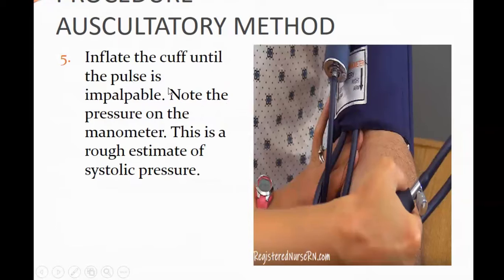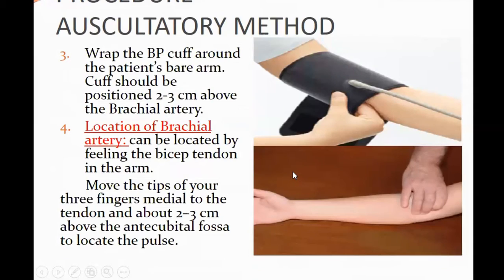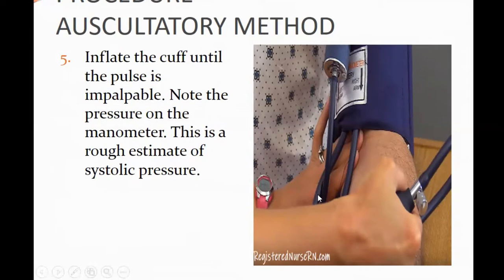Now, students, this is basically the palpatory method, and the palpatory method is incorporated into the auscultatory method, because the palpatory method gives you a better estimate of the systolic pressure, and this can be done also on the radial artery. You can palpate the radial artery and determine the systolic pressure with the palpatory method. While palpating the radial artery, the procedure is the same: the cuff would be positioned above the anterior cubital fossa, and you will be palpating the radial artery and determining the systolic pressure by inflating the cuff, and when the pulse becomes impalpable, you take the reading.